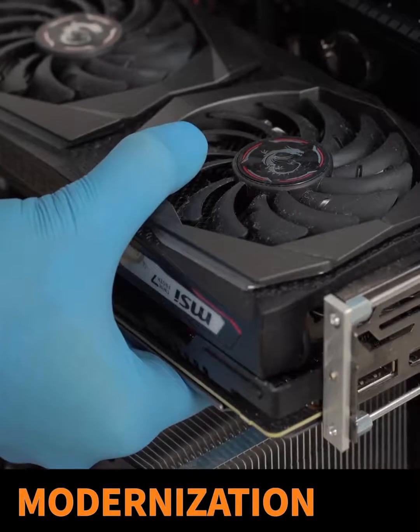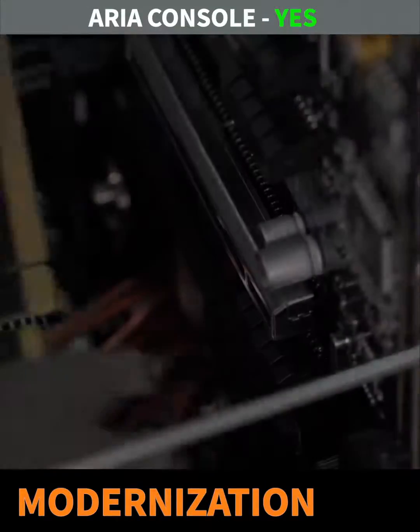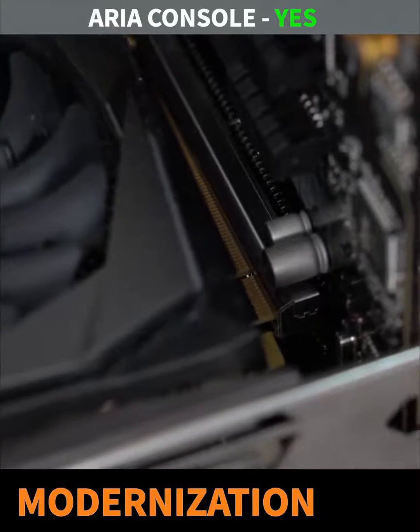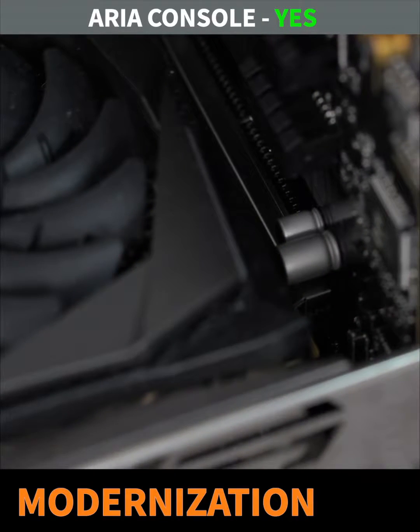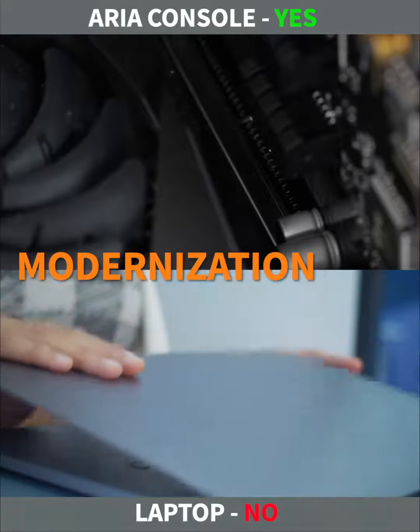Intraoral scanners are continuously updated and may require a PC upgrade to operate smoothly. Console PCs can be upgraded to save costs. Laptops are no longer upgradable, so you need to buy a new one.